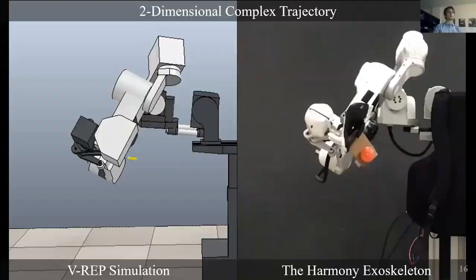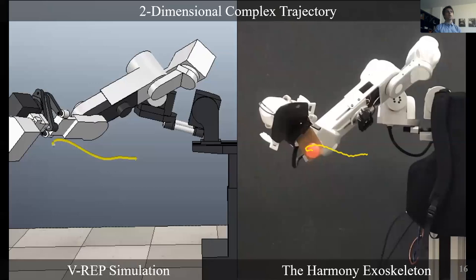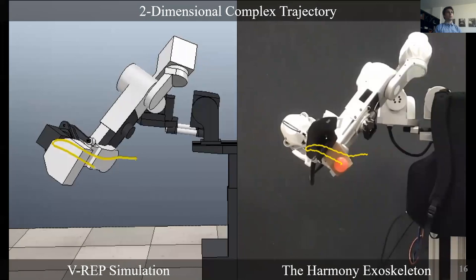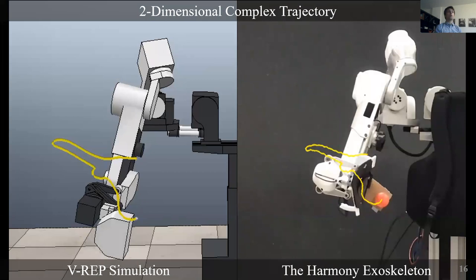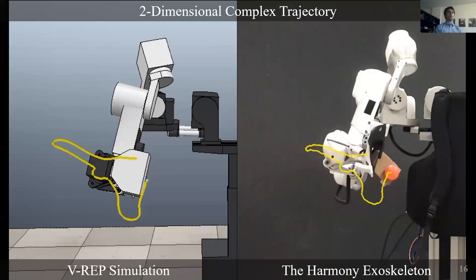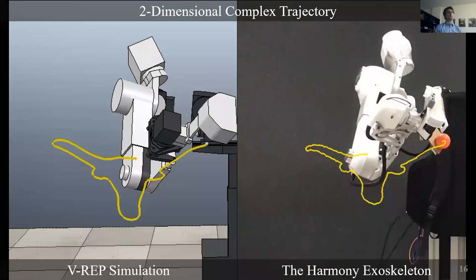Now, as I mentioned before, we also tried to perform some complex trajectories both in 2D and 3D with a VREP simulator that you can see on the left and with the Harmony robot on the right. We can actually see that both the robot and the simulator were able to follow the complex trajectory that we computed with the method. On the right, you can see that there are some errors and vibration. These are only due to the low stiffness parameter of the impedance controller of the Harmony robot that is kept very low to avoid to harm the user.